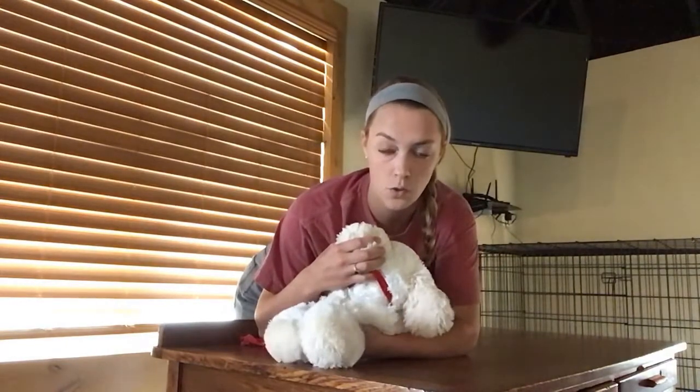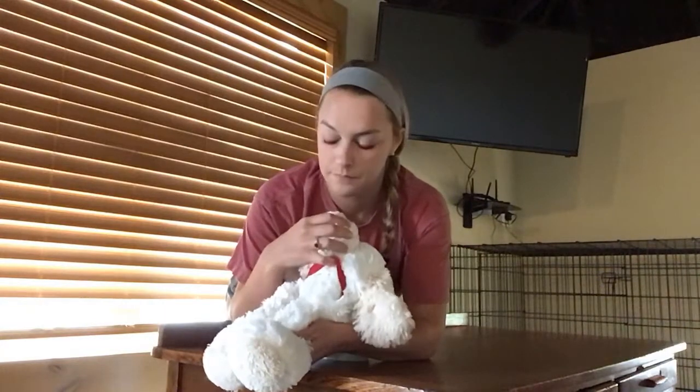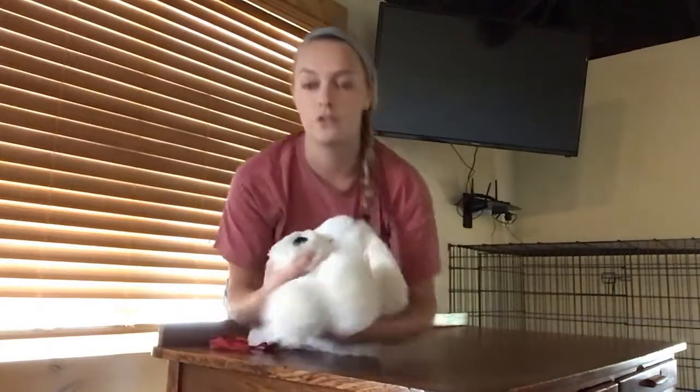Once here, I'm still controlling the front limbs with my left hand. I can advance them forward over the edge of the table. This is going to allow the blood draw optimal access to that jugular vein on either side, whichever side they want. And that's how you do a restraint for a jugular vein blood draw.